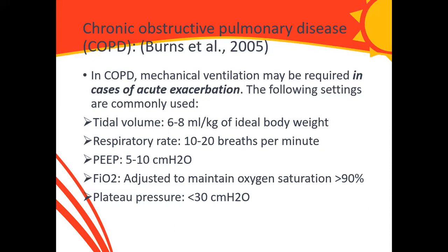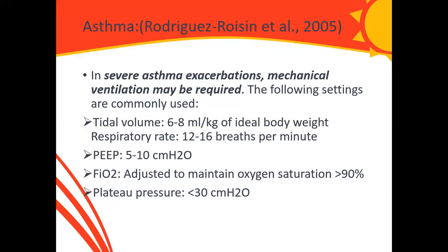But when there's an acute exacerbation of COPD, you want to do invasive ventilation, with a tidal volume of 6 to 8, respiratory rate 10 to 20, and PEEP 5 to 10. You want to maintain your FiO2 to a saturation SpO2 of greater than 90. Plateau pressure should also be kept below 30 centimeters of water.